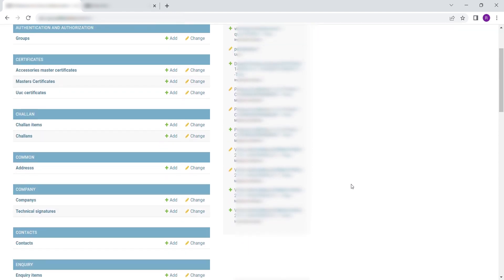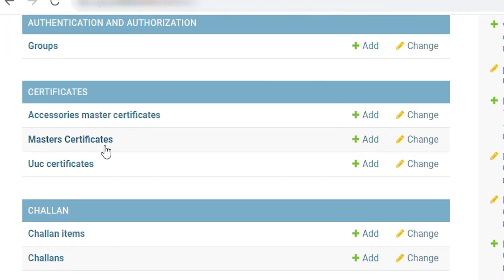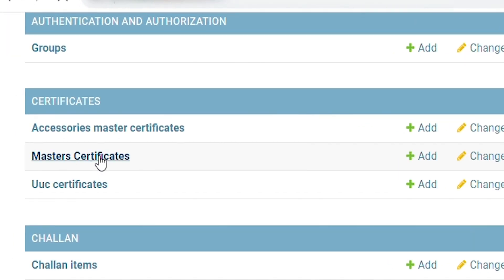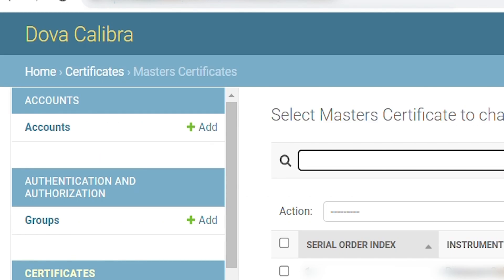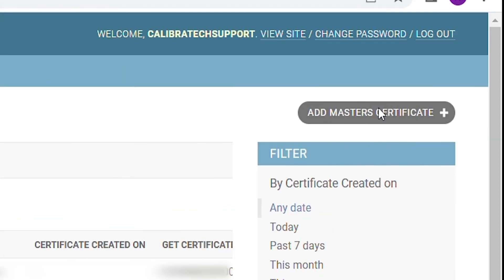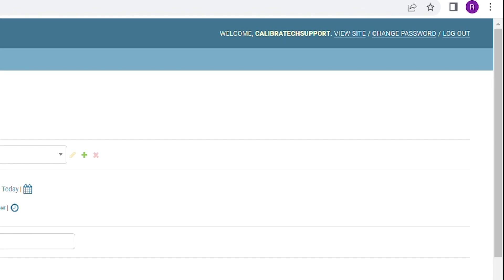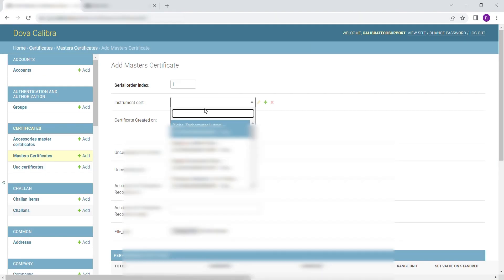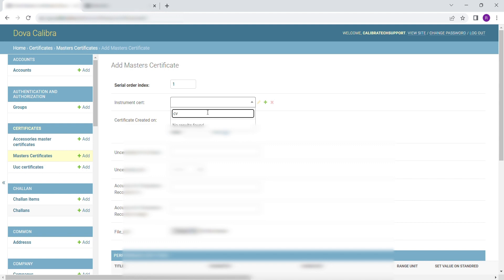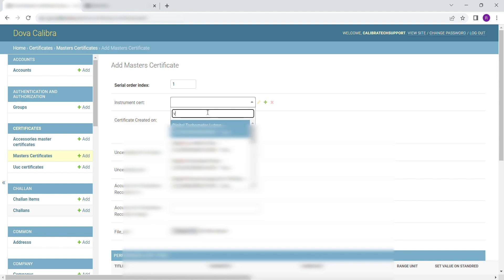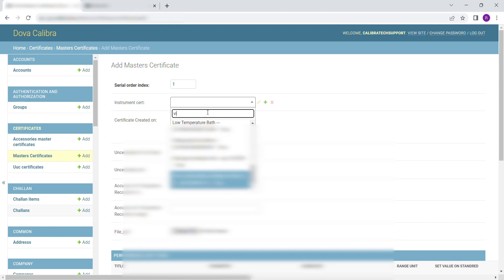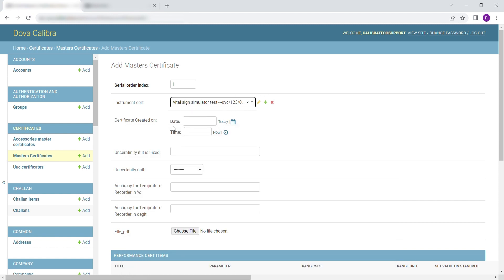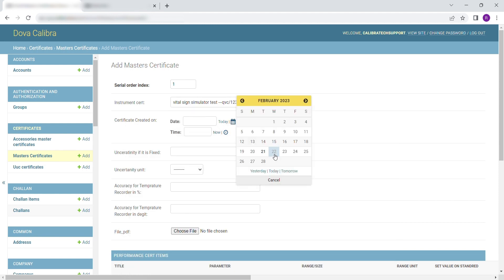To enter Master Instrument Certificate, scroll down to Certificates. Select Master Certificates. Then click on Add Master Certificate. Fill in the following details, like Serial Order Index. Enter the Instrument Certificate details and Date Details.